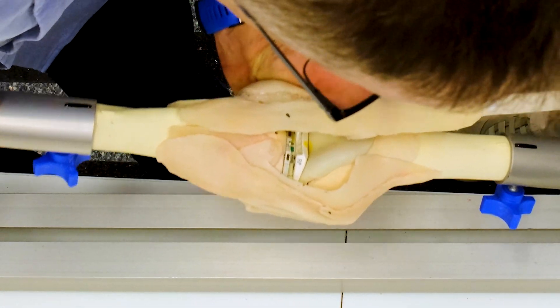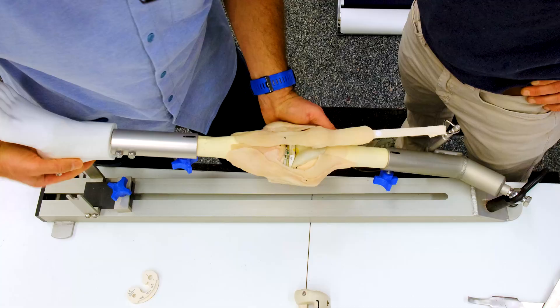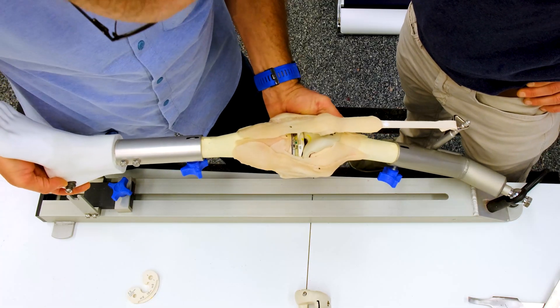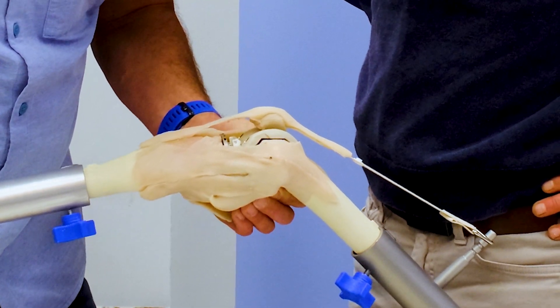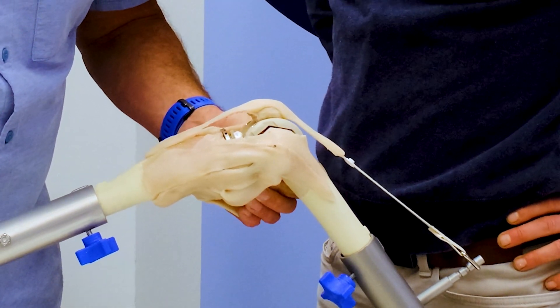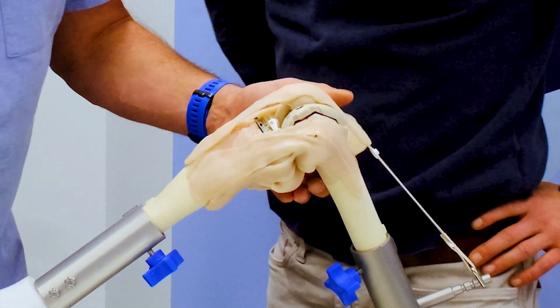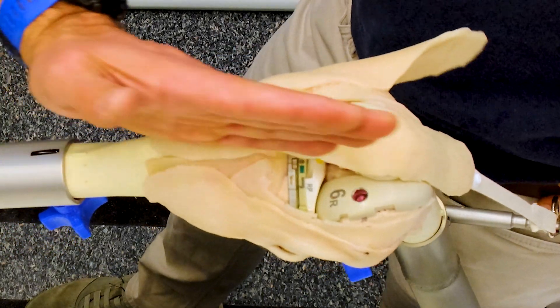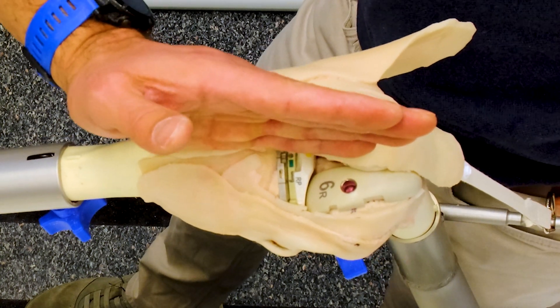Ligamentously, we like how it sits. It's got a little play in valgus, a little play in varus. But as we go from extension through a flexion arc, you can see that the patella sits high on the femoral groove. Then at about 40 degrees of flexion it starts to sit in. And if you look in deep flexion, you can see the increase in our quadriceps angle.